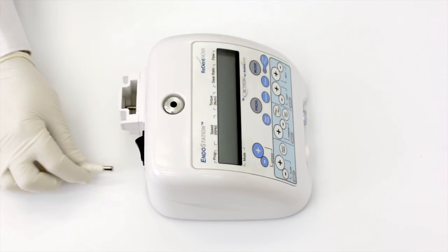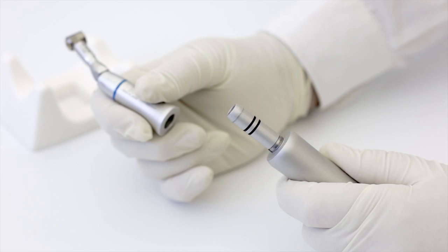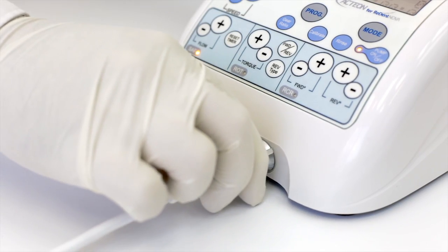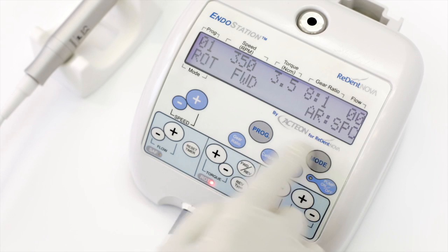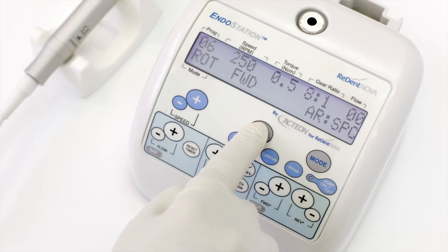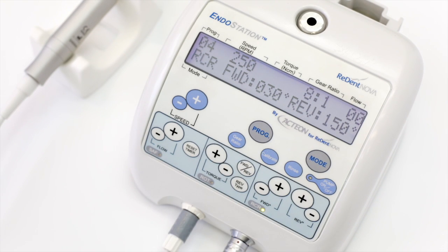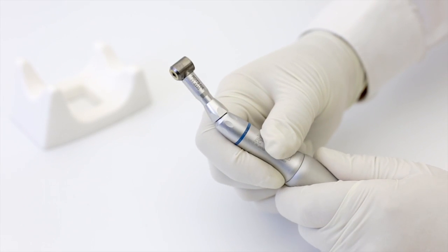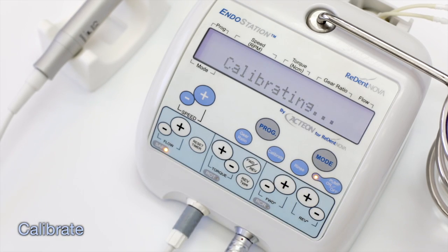Plug in the power transformer, connect it to the endo station, and switch it on. The endo station has an E-type micromotor compatible with various contra-angle handpieces and is operated by a footswitch that controls the endomotor and the irrigation pump simultaneously. Connect the micromotor and footswitch plugs into their designated sockets. Choose the desired mode of operation by pressing the MODE key and toggle to the program you wish to update by pressing the PROGRAM key. The SAF system mode includes three programs, of which the first is fixed and the other two are programmable. The rotary and reciprocating modes have ten programmable programs each. Connect a contra-angle handpiece suitable to the selected file system, adjust the gear ratio accordingly, and perform a torque calibration by pressing the calibrate key.